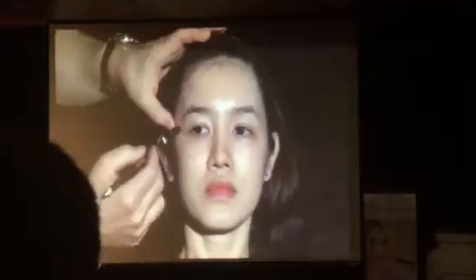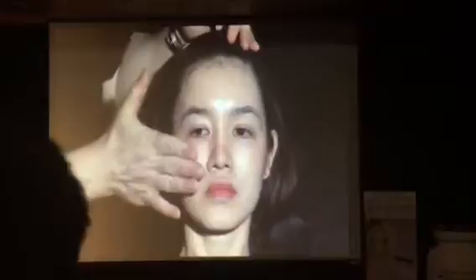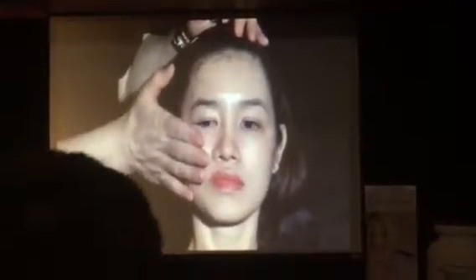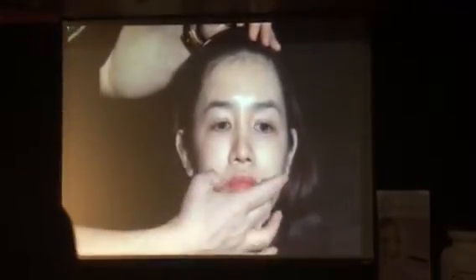And we usually do the more sagging side or more flat side first. So the plan for her, I will do the mid-face, the 8-point lift, right side first. And then I do a little bit over the chin, and then I do the lips.